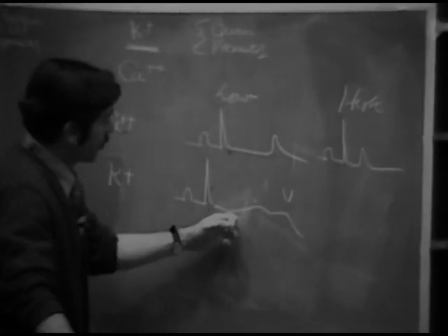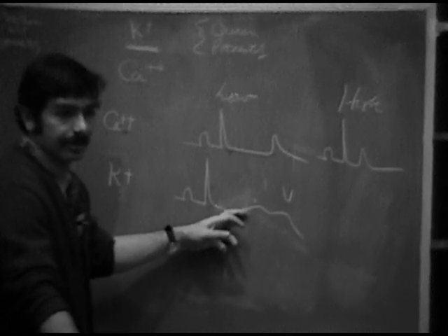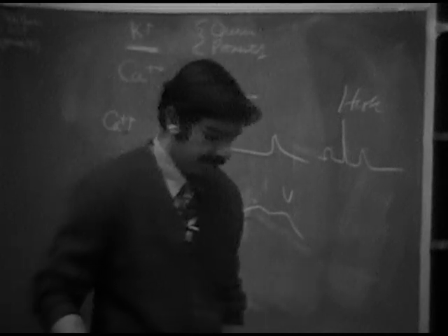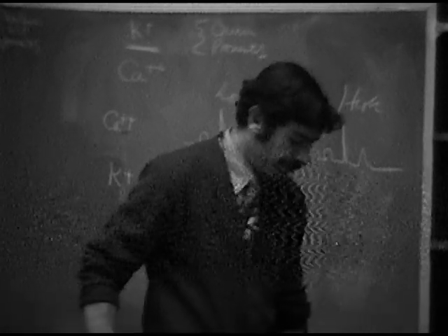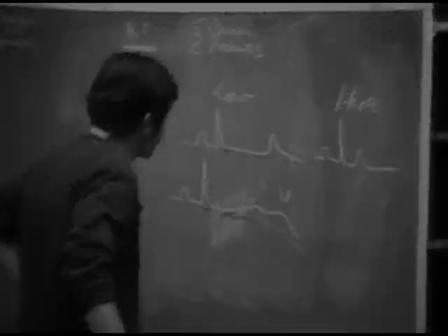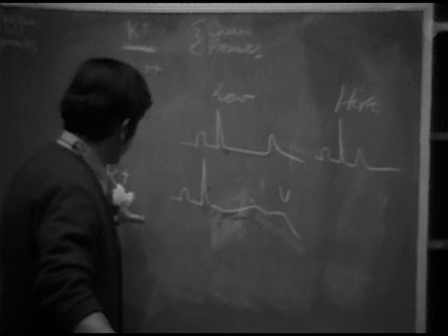I consider it very important to be able to pick this up on the electrocardiogram. This is quite sensitive and should lead you to some definitive therapy, which in some cases can save someone's life. I think that the recognition of hypokalemia is extremely important. Now, the effects of quinidine and procainamide look very much like the effects of potassium.